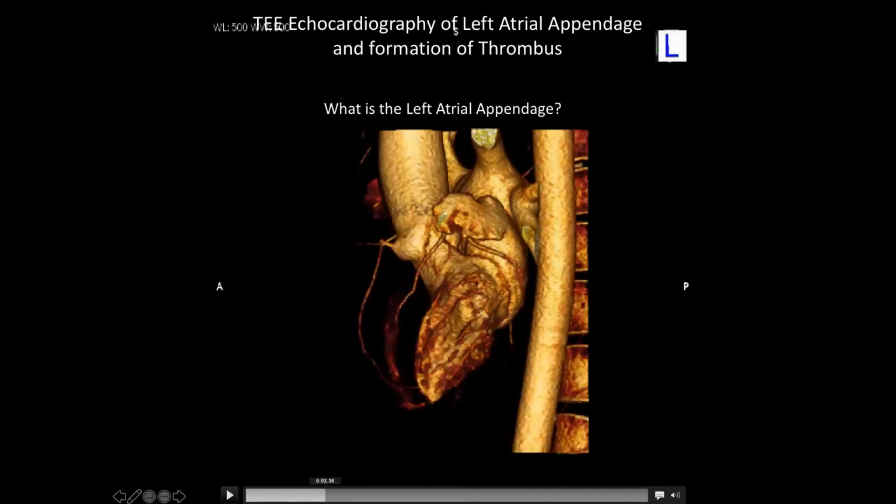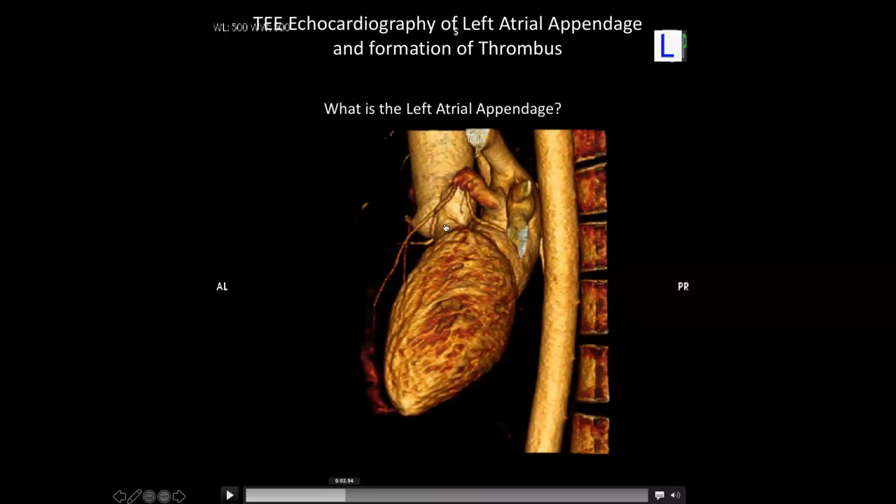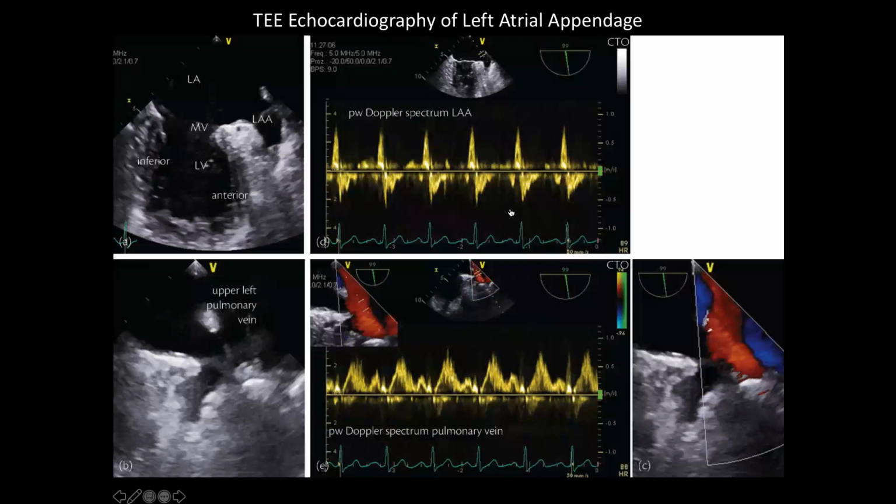It is something that's imaged with ultrasound a lot, right? And as you can see, when the left ventricle ejects and you fill up the left atrium, this thing also expands out. It's like a bag on the side. So it'll double its volume or even triple its volume, right? And then when the atrium contracts, so does it, right? You can see a little thing, it contracted back and squashed blood out. And so blood is going to go through this orifice right here and back out into the left atrium. Okay.